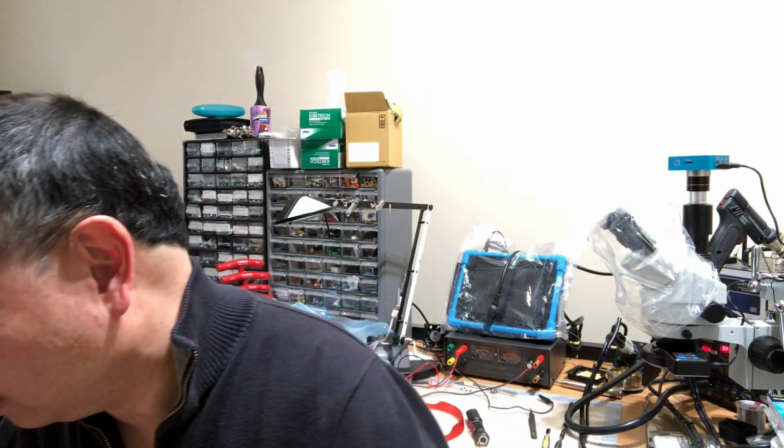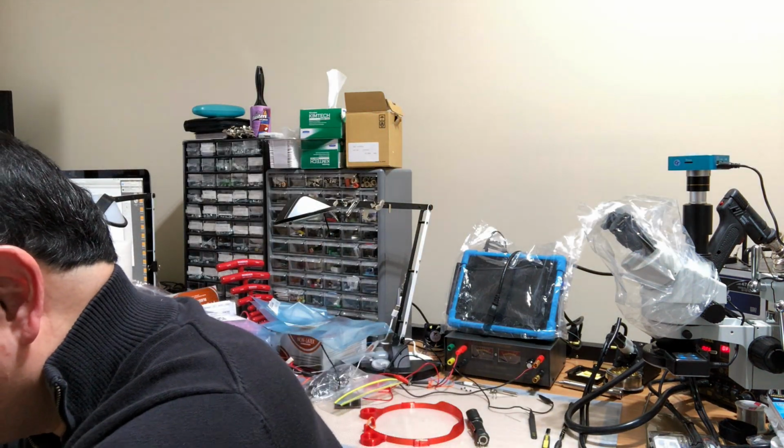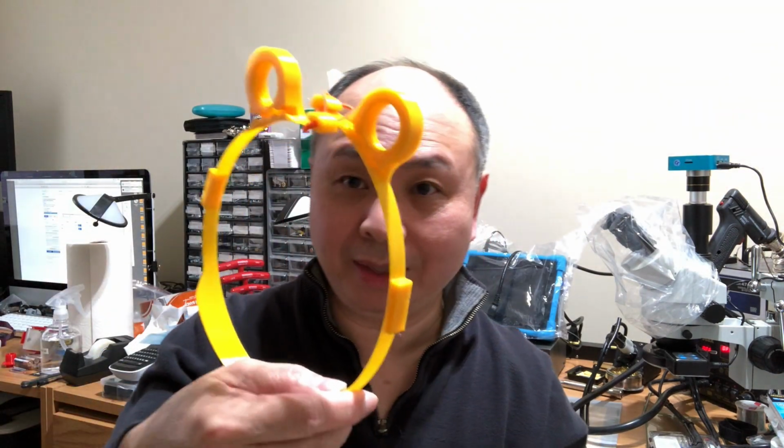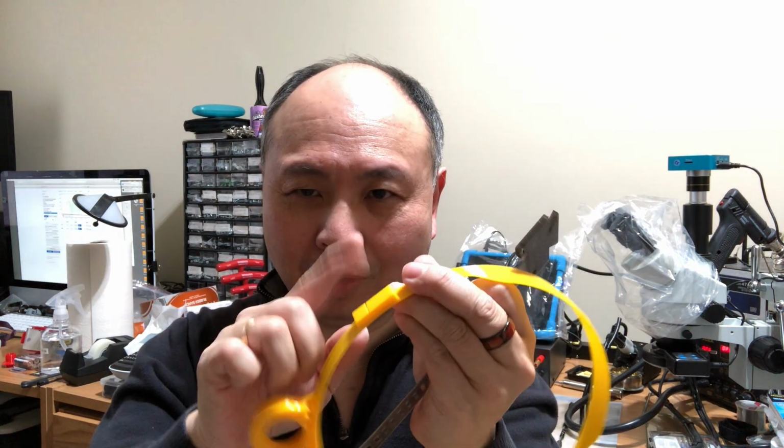There. Now, you notice that was not very easy, and some people just didn't have the coordination to handle working with the hook. So the newest version of the Halo loop no longer has hooks.